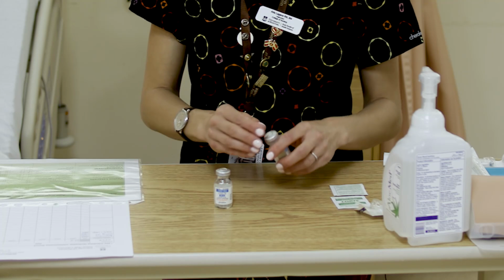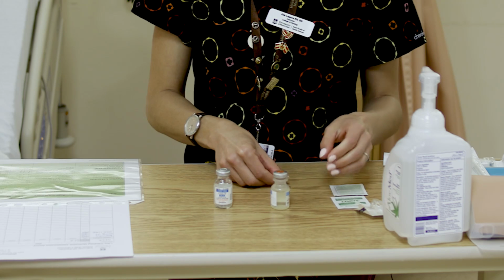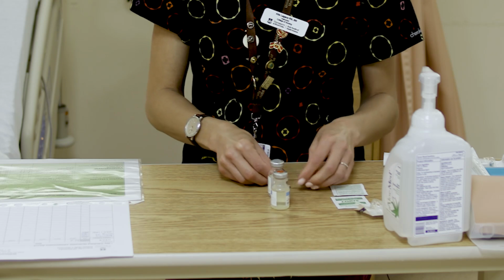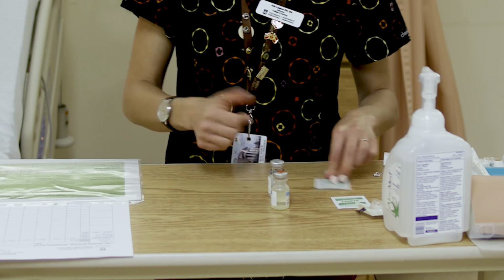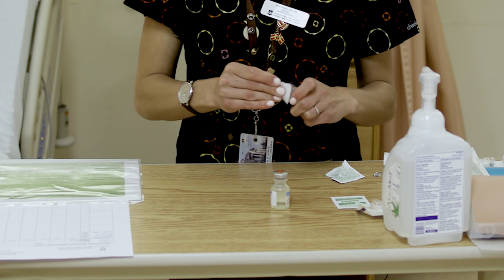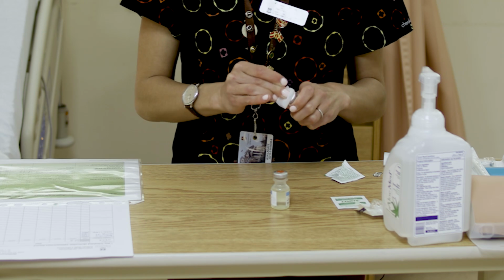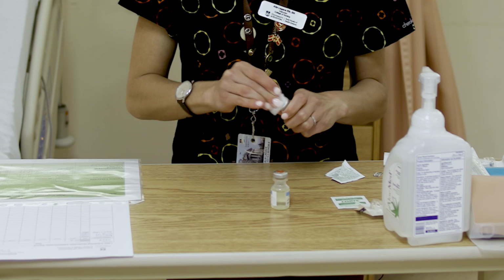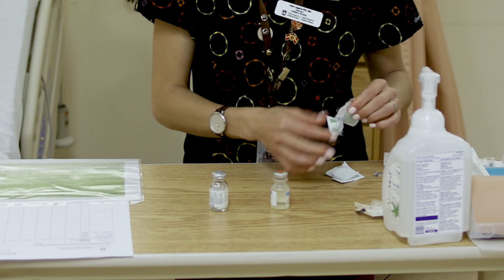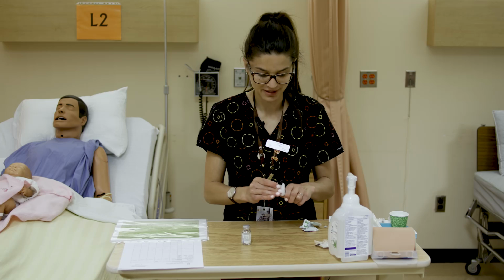So we're going to open our vials and clean our vials to get ready to draw up the sterile water. So opening the same way with the underside, getting underneath those metal tabs, or maybe it's a plastic flip top, and then we're going to clean them again. So cleaning them really well, starting at the center, really working around there for about 30 seconds, trying to get that top nice and clean. We just speed up for video purposes, but you'd want to make sure 30 seconds is actually a long time when you sit down and do it or count it.